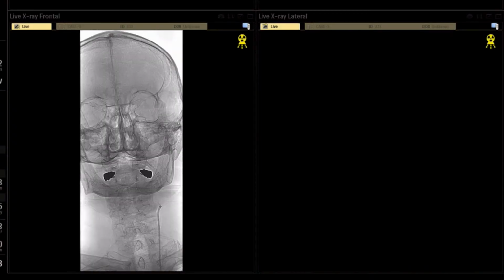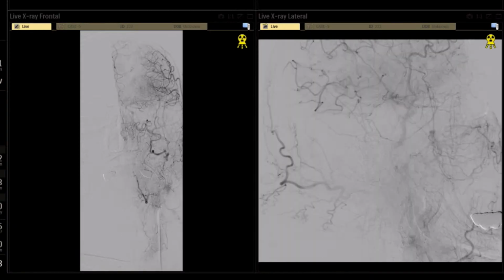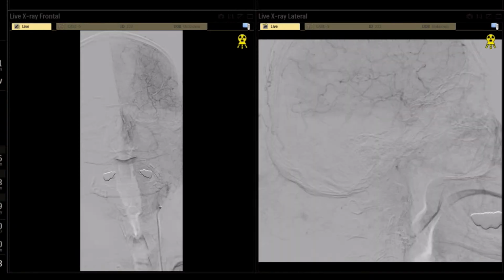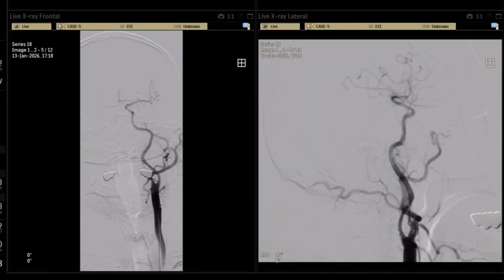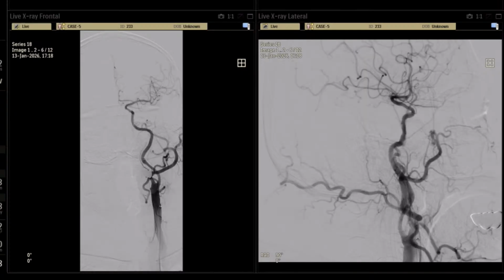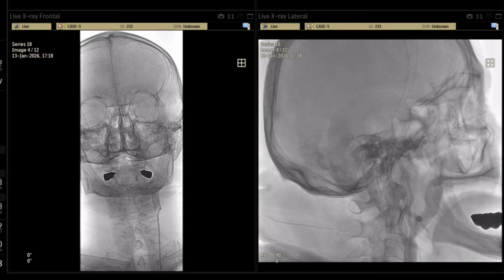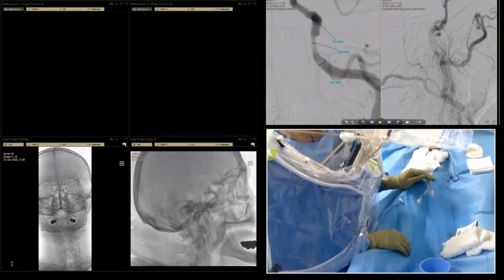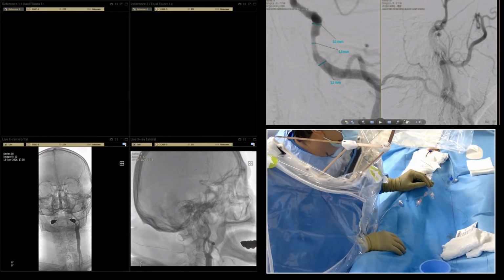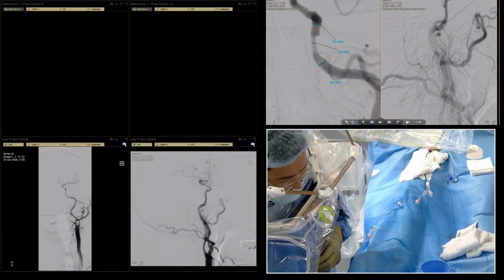On lateral. Yes, it's okay. It's not 100% angioplasty, it's remaining nearly 30 to 40% of the stenosis, but it looks like there is some plaque protruding, but there is a mesh inside. That's why we can go to the right side.